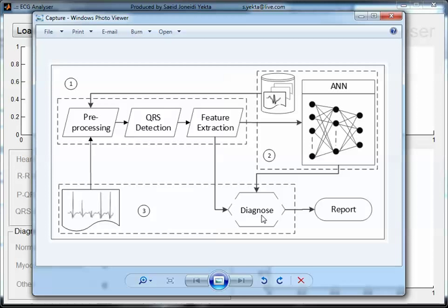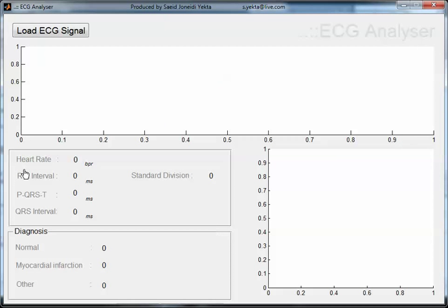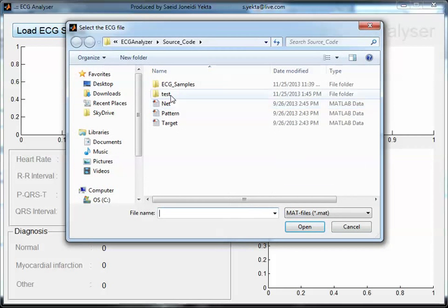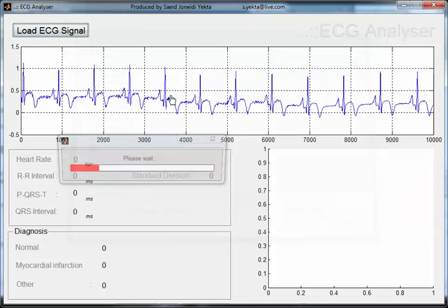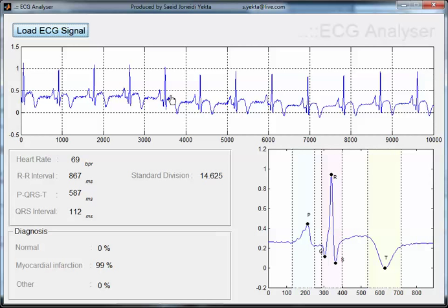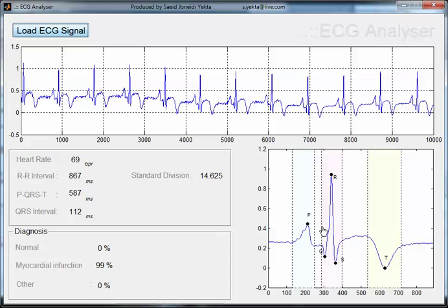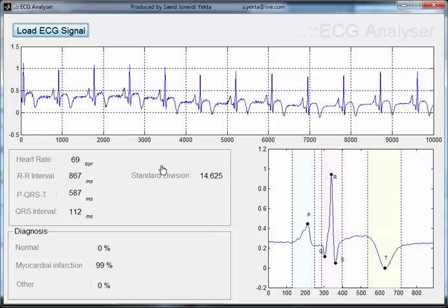Let's go back to the user interface and check some samples. In this plot we can see the entire signal, and here we have a visualization of one cycle of the heartbeat. We can also see the result of feature extraction here, which involves more detail about the signal such as heartbeat, RR interval, and so on.